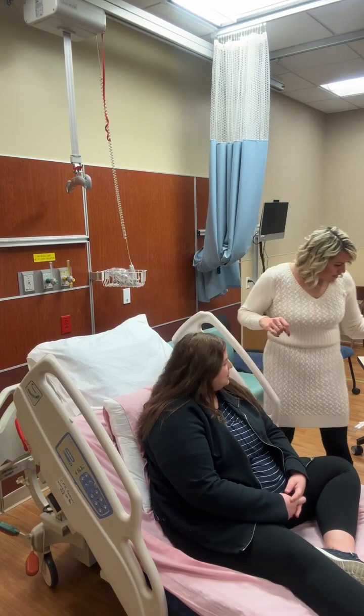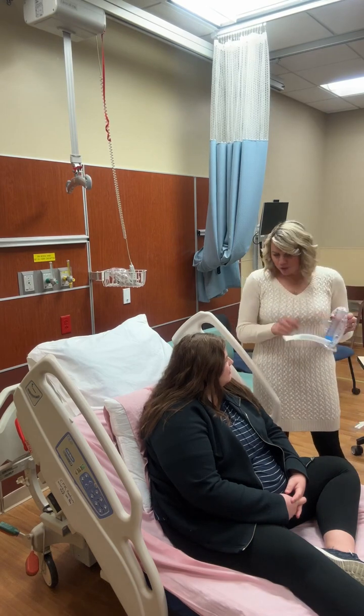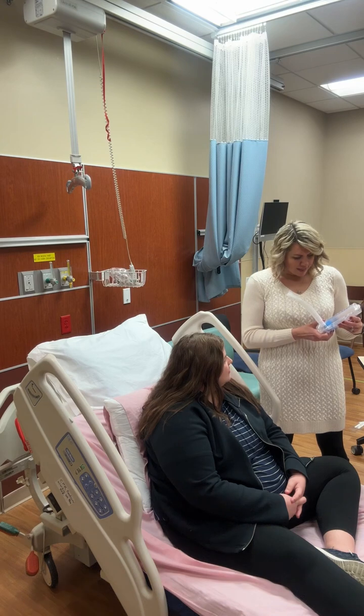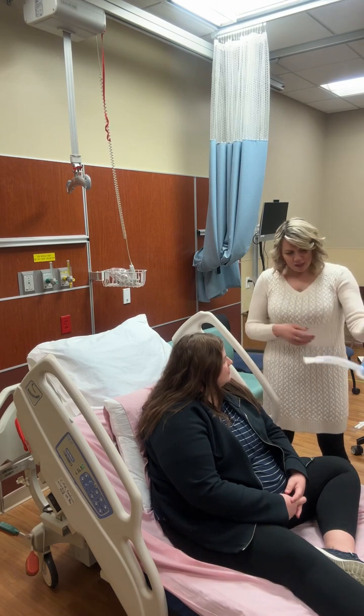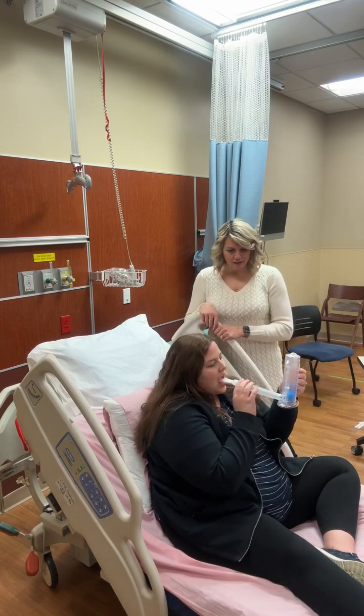Okay, Ashley, so we did your incentive spirometer earlier, I think. The nurse wrote it down, and it looks like you got 500 on this last time. Can you show me, can we do it again? Yeah. Okay. You remember how to use it? Oh, yeah. Okay. Yep.